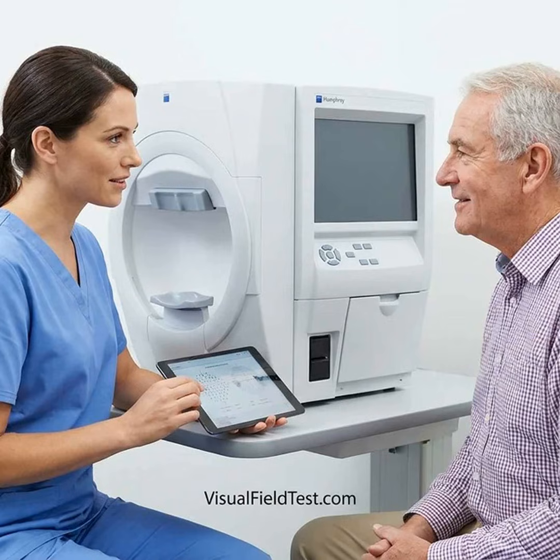Application-based home module or home visual field test. Use only an application or device recommended by your eye care professional. Confirm whether the application is for education only or whether it is a validated medical visual field test. Use the same device, screen, viewing distance, and corrective lens each time. Test in a quiet area without television, conversation, glare, or screen reflections. Sit in a stable position and follow the application's instructions for covering the other eye. Complete the tutorial and teach-back questions before the first test.